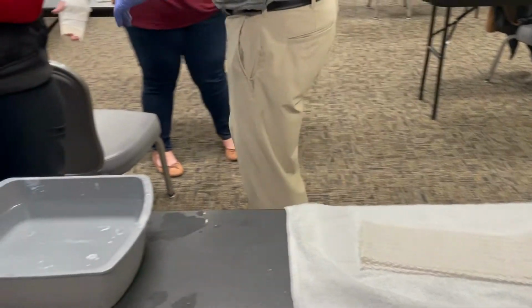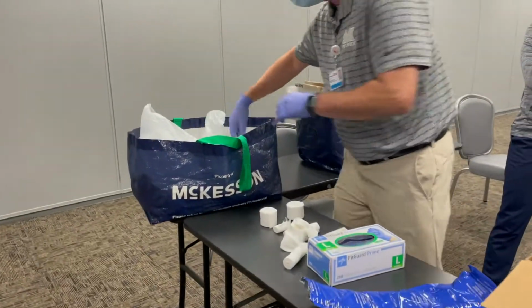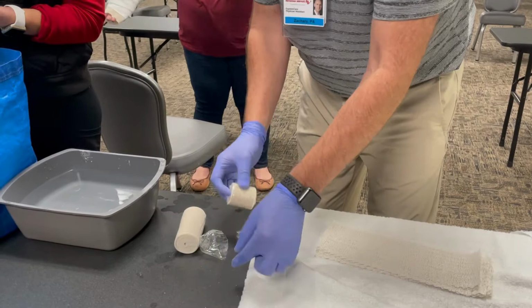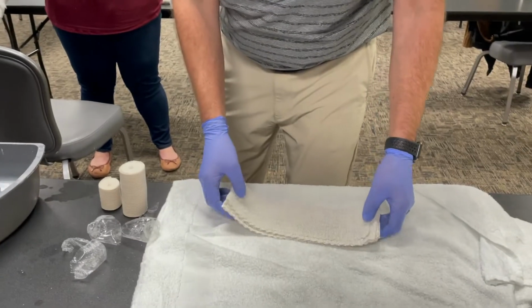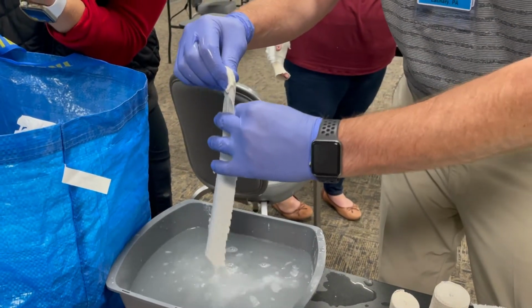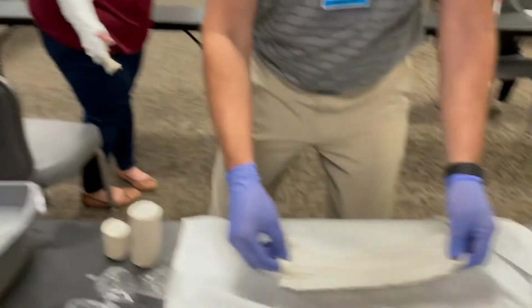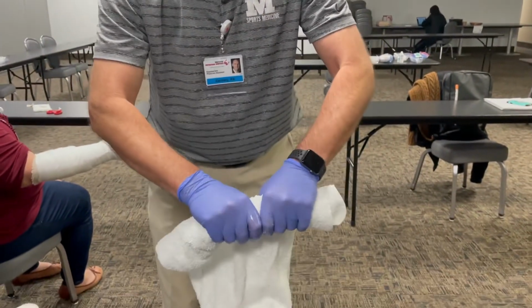And you want to have your Ace wraps ready before you wet it down. That's another thing I should have said before. But so I've got a 2-inch and I've got a 3-inch. That's plenty. So have that ready. So those are ready to go. We're going to dip this in the water. And you can kind of give it a quick wring out here. I'm using my fingers just to kind of squeeze it out. And I'm going to come over here and we're going to roll it up. And now is where you're giving it a really good squeeze to get all that water out.